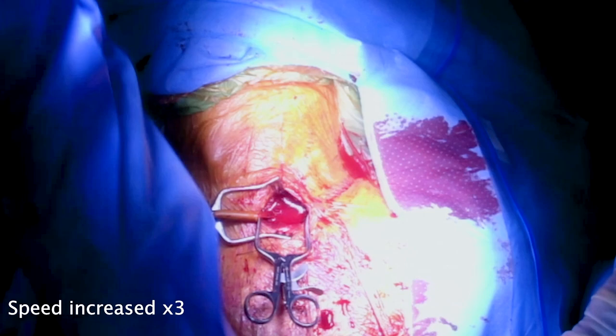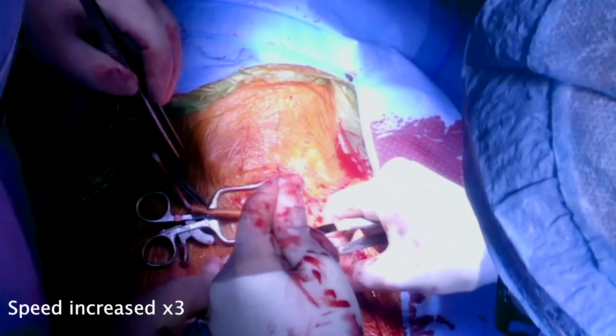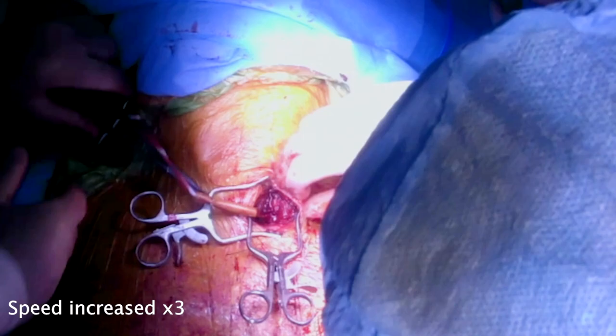The umbilical tape also facilitated arterial access via the elevation of the left common carotid artery, and also helps to avoid back wall injury during arterial access.